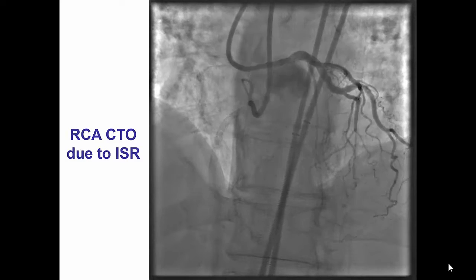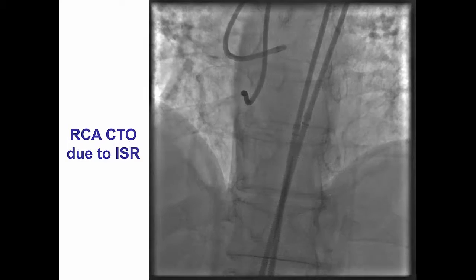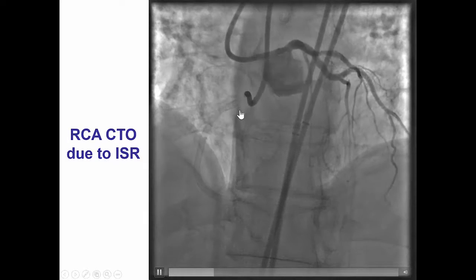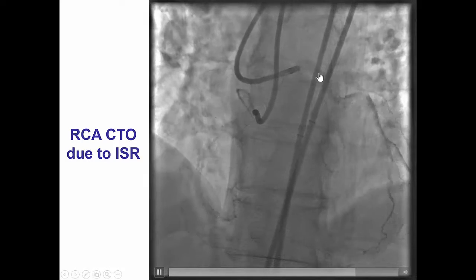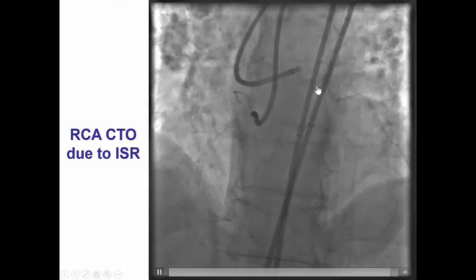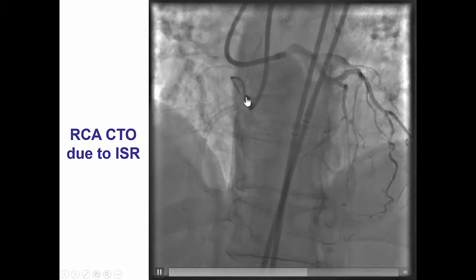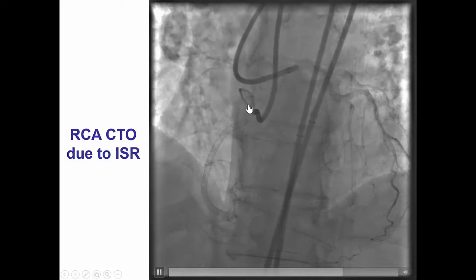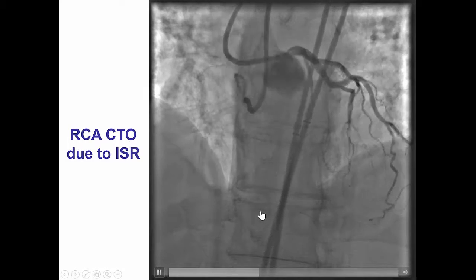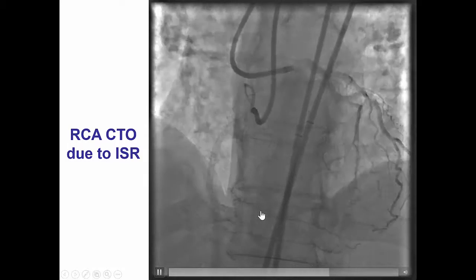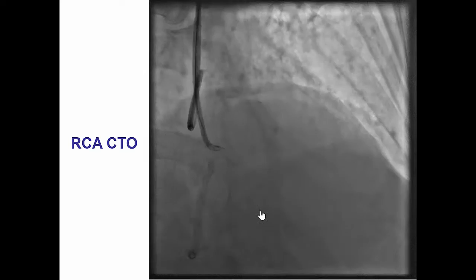The patient had multiple previous stent procedures of the right coronary artery when he returned with recurrent angina. He did not have any disease on the left coronary system; however, the stents were occluded. We now had ostial occlusion of the right coronary with occlusion of the stents all the way to the PDA. Therefore, it was a very extensive area of occlusion.